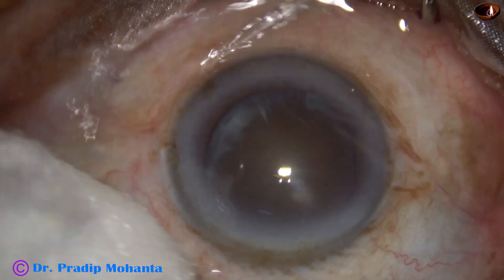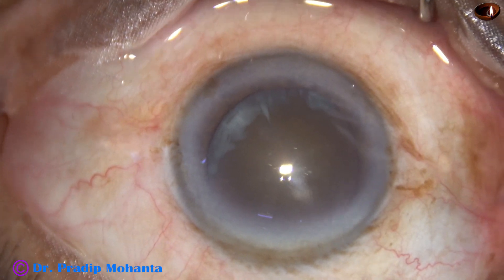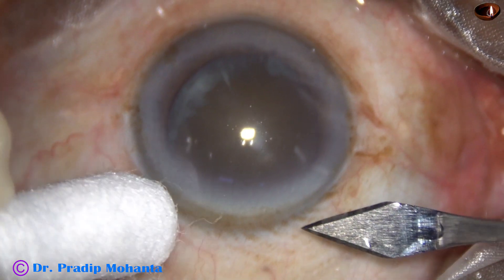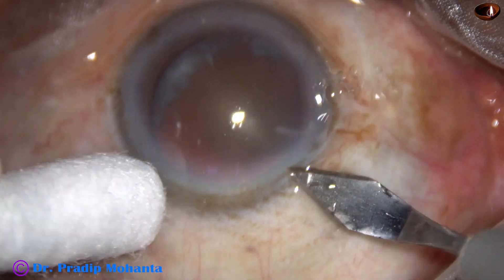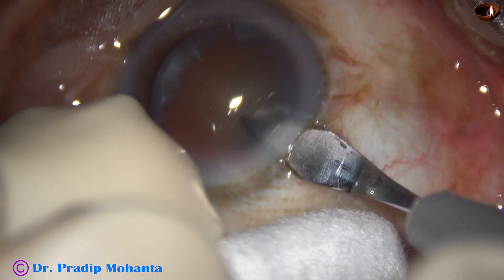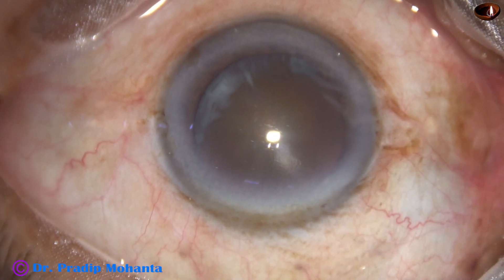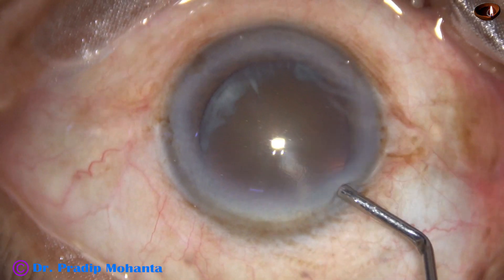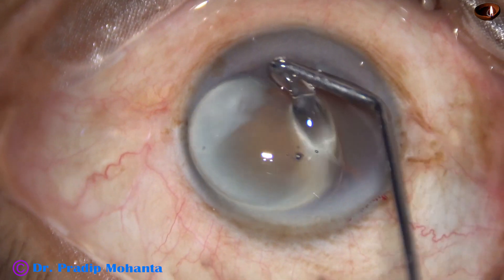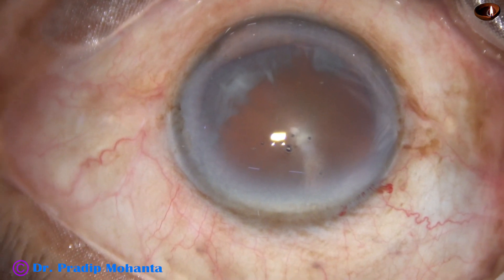After thorough irrigation of the ocular surface with Ringer's lactate or balanced salt solution, this is the main incision with a 2.8 millimeter steel keratome at around 11 o'clock. Now 2% hydroxypropyl methylcellulose is filling up the anterior chamber and is applied over the corneal epithelium for better visibility.